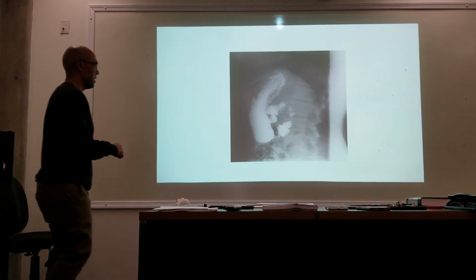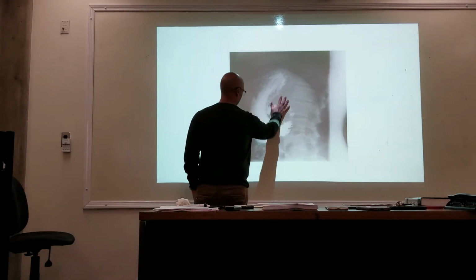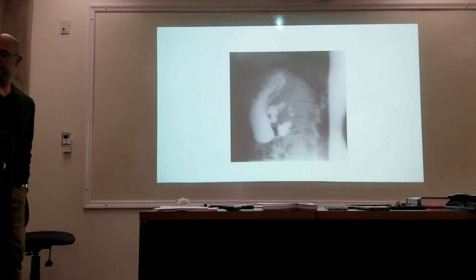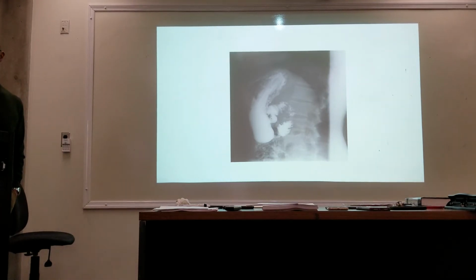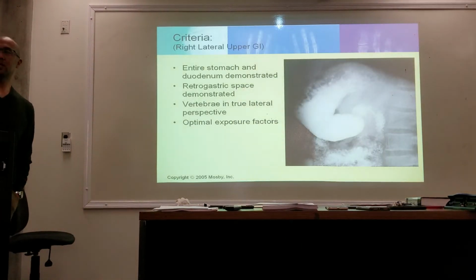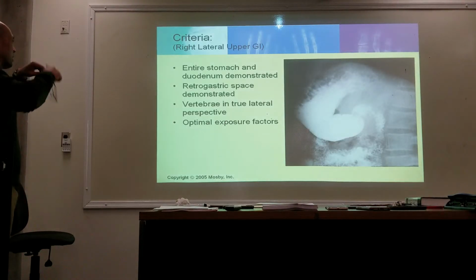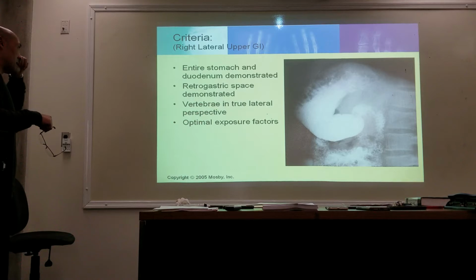So you're seeing the area behind the stomach, retrogastric space. It's good for that. So the entire stomach and the duodenum are demonstrated. So is the retrogastric space.